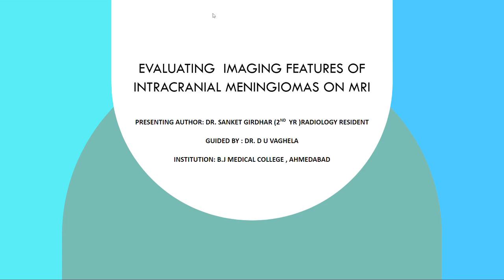imaging features of intracranial meningiomas, and it discusses various imaging modalities including CT and MRI, which are used in diagnosing meningiomas, highlighting their typical appearance and associated features. This will also discuss the vascular features and will also try to differentiate between typical and atypical meningiomas based on MRI studies.